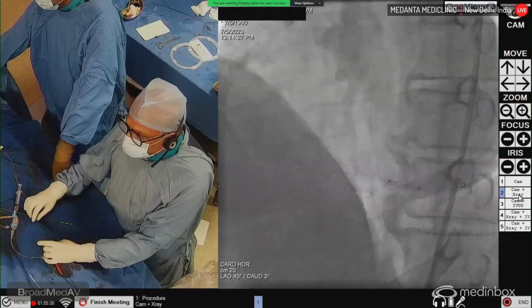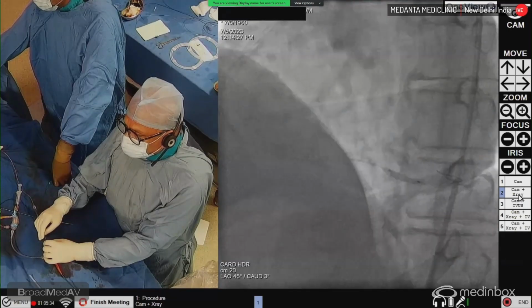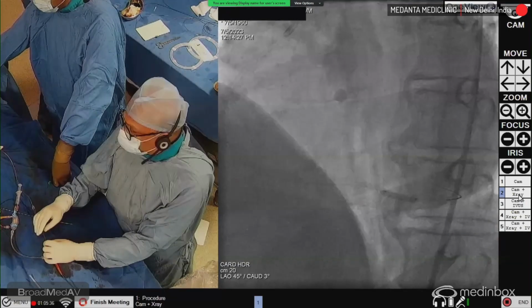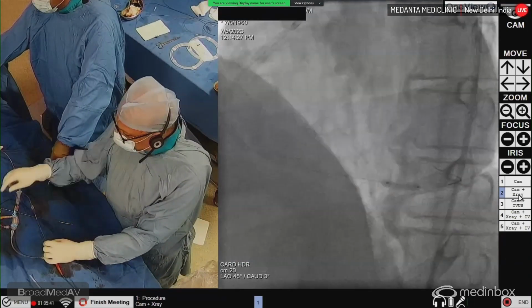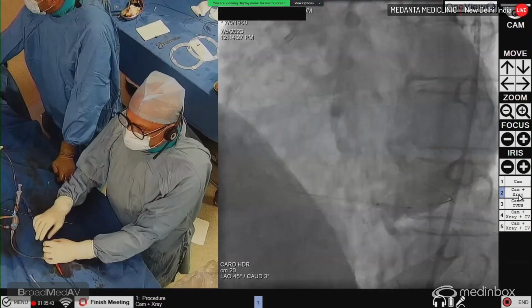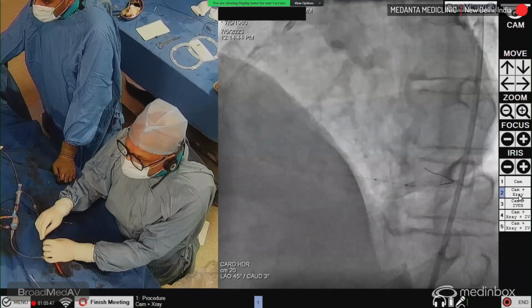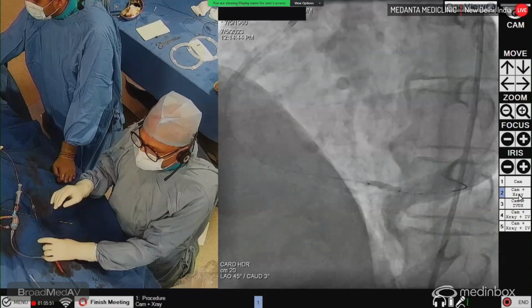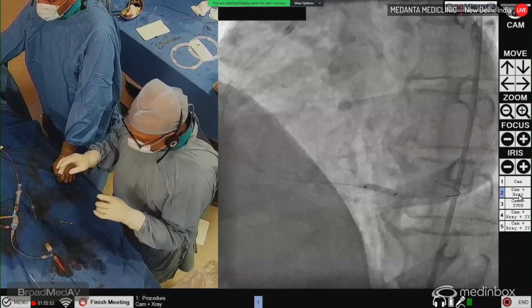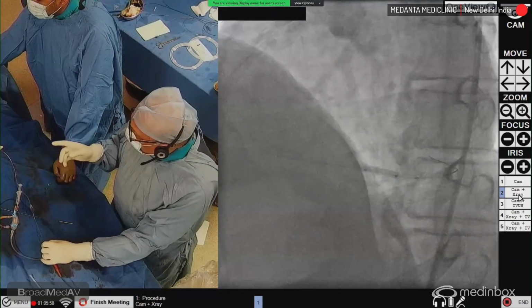Keep it there for 10 seconds, 20 seconds. Now it is expanding slowly. So these fibrotic lesions sometimes take their own time to expand. 12. Yes. Deflate. 12. 14. So proximally, as you saw that there was a calcific ring there, which we are going to break, deflate.